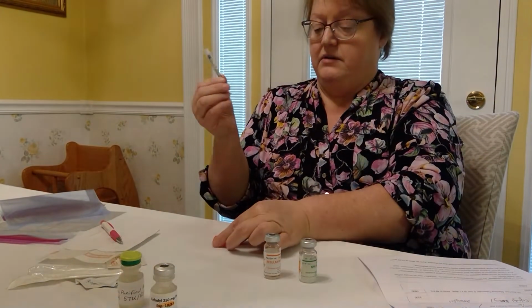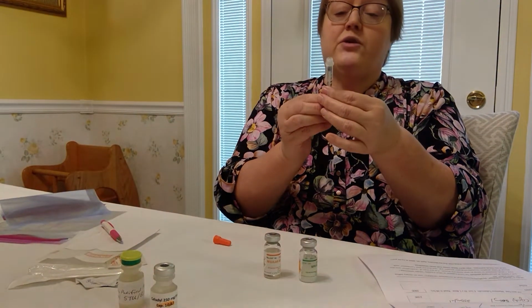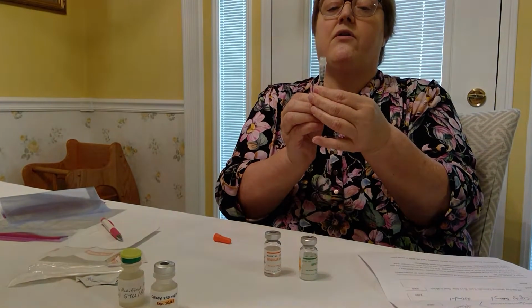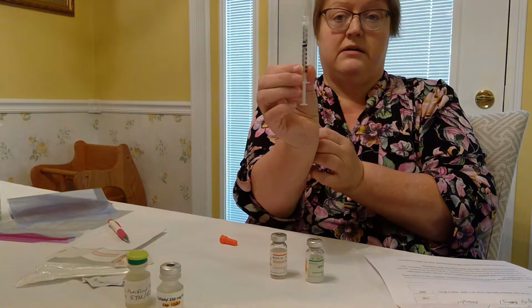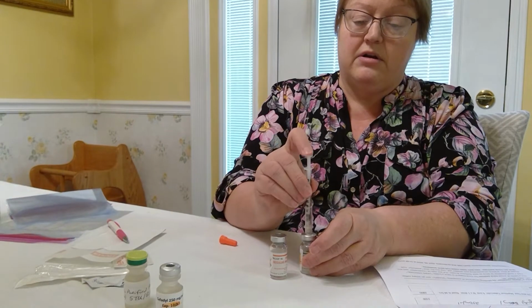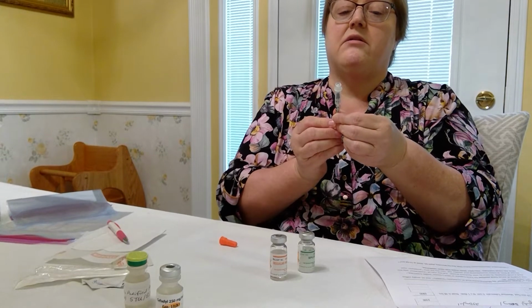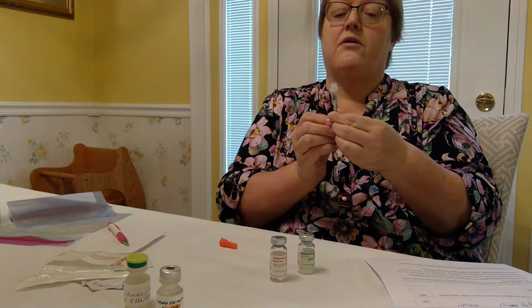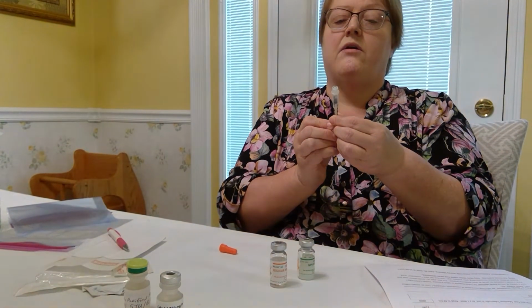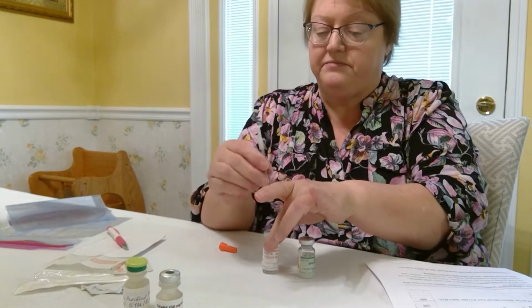Remove the cap. And the first thing I'm going to do is inject 32 units of air into my cloudy or NPH. Then I'm going to inject 16 units of air into my R.